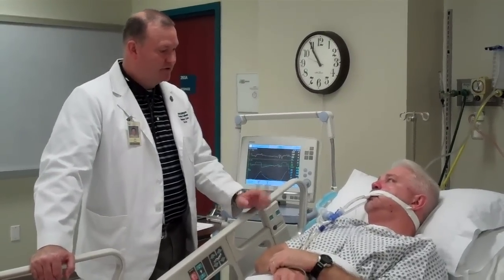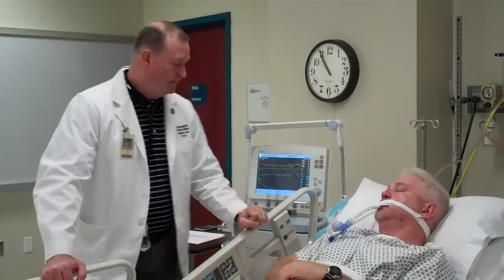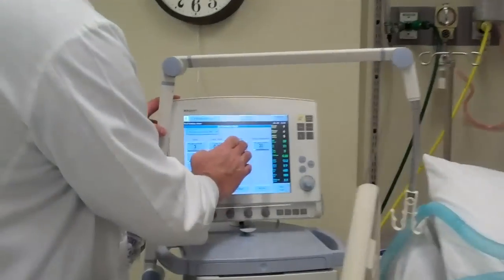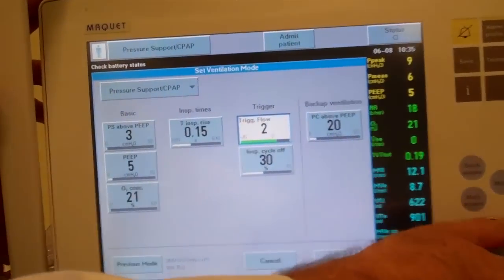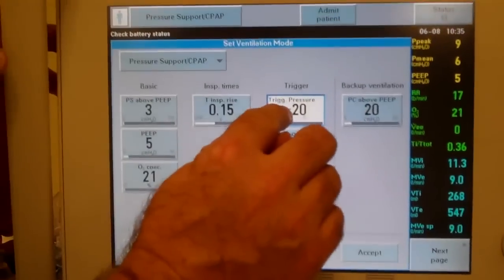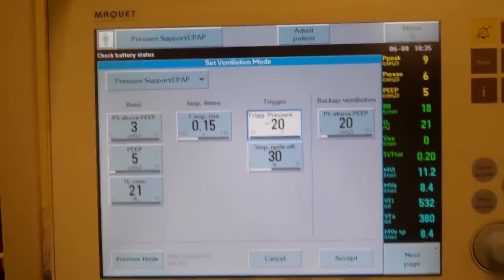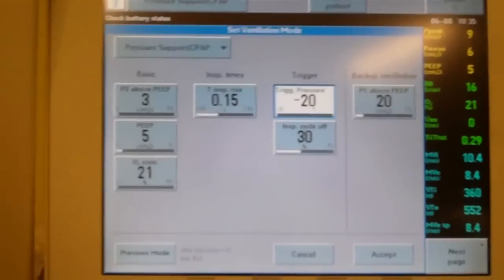If you can't get the air in, I'm going to disconnect you from this and reset the ventilator so that you will be able to breathe, okay? The main thing is just when I tell you to, take that good, strong deep breath in as hard as you possibly can. So before we have him do that, we need to make sure that we have our trigger sensitivity set and we need to drop that down to a minus 20. Now as soon as I hit accept, that mode's going to kick in and he's going to have to breathe at minus 20 in order to get a spontaneous breath.